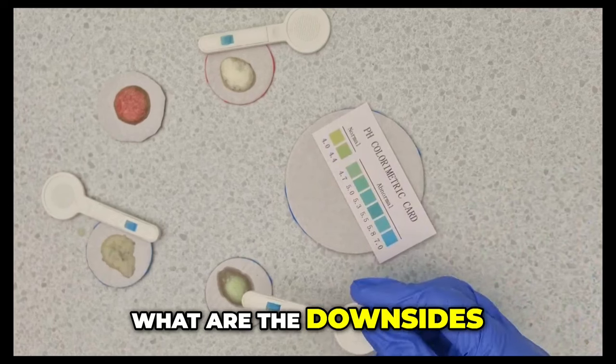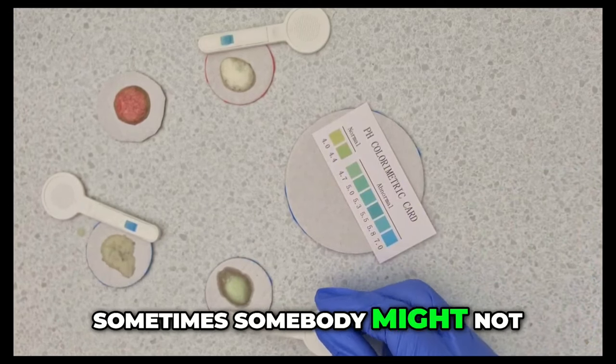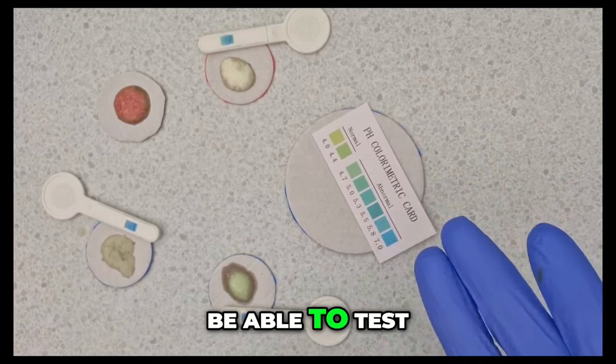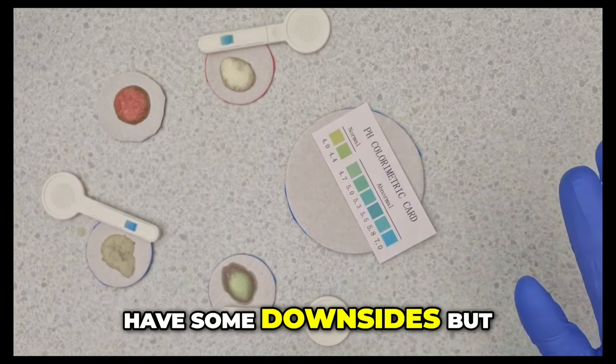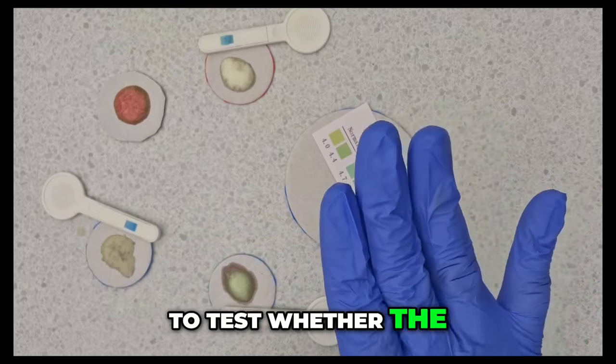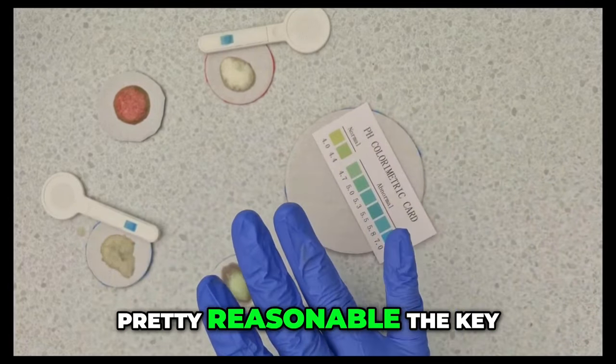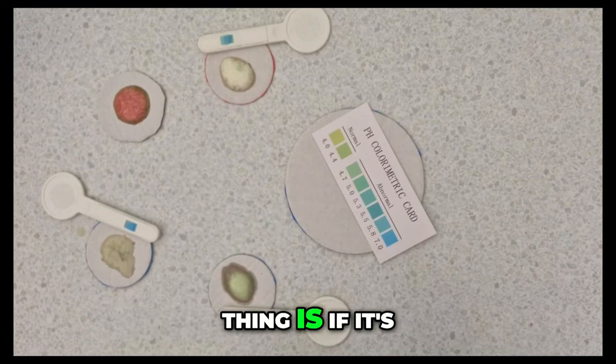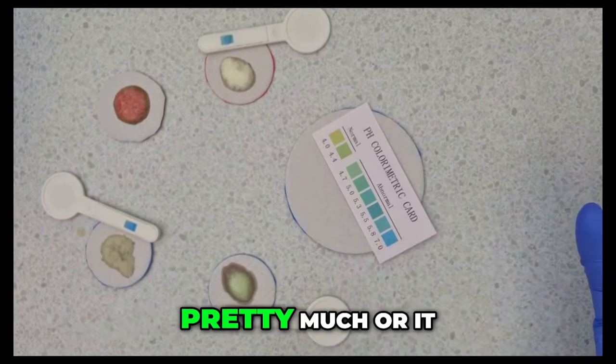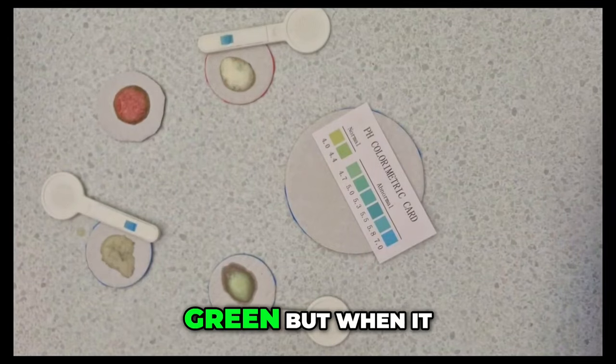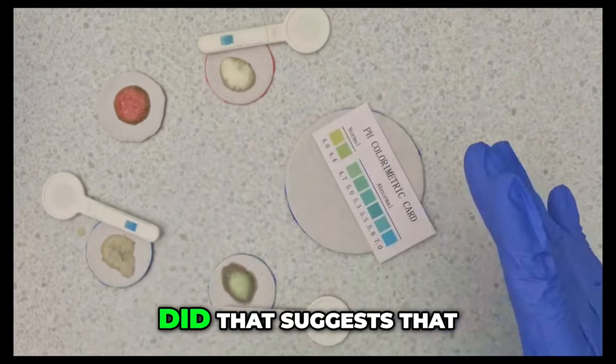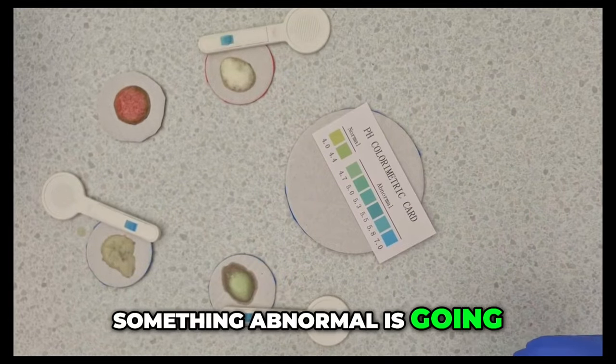What are the downsides? Sometimes somebody might not do it properly. You may not get enough of the discharge on the kit to be able to test properly. So it does have some downsides. But if you do get enough of the discharge and it's being used to test whether the discharge is normal or not normal, I think that's pretty reasonable. The key thing is if it's a normal discharge, the kit shouldn't change color pretty much or it should just remain light green. But when it changes to a clear blue, like all the ones I've got here did, that suggests that something abnormal is going on.